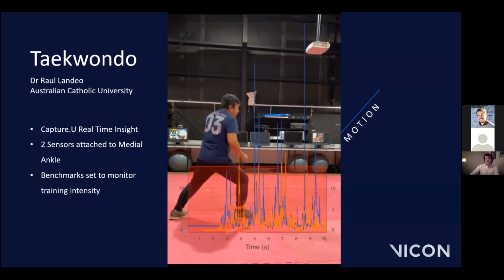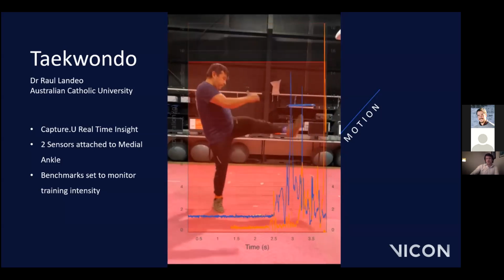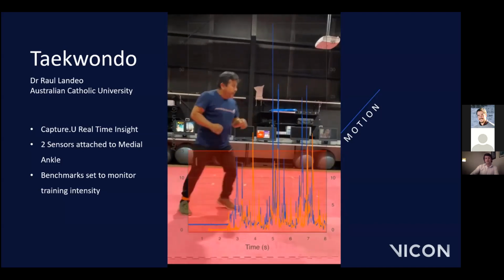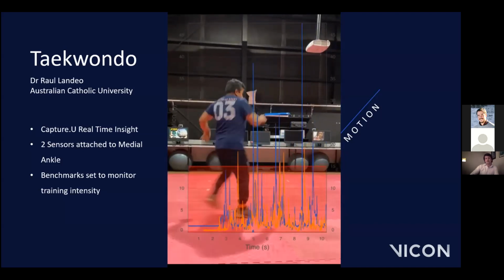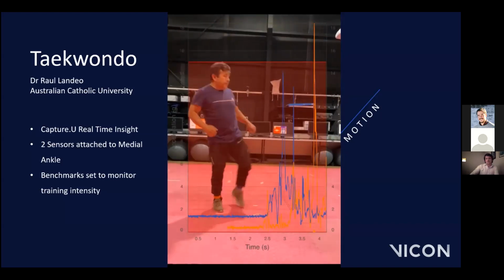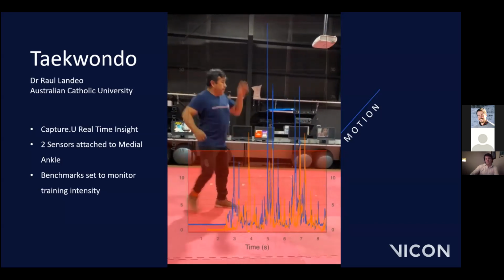These are produced when the resultant acceleration goes above a set benchmark. This can be used to track the intensity of each kick and provides audible feedback to the athlete. Again, this can be used if returning to sport after injury, and if you don't want to overexert yourself, then you can set a limit.